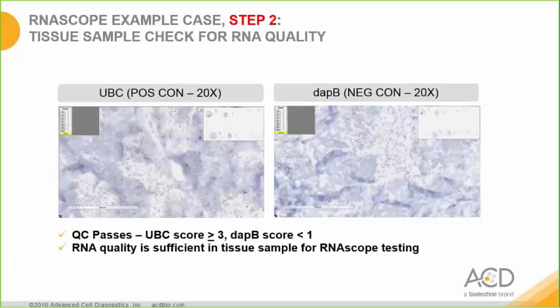Having confirmed the proper technique for running the RNAscope assay, we can now proceed to checking the tissue sample for RNA quality. The same control probes are used here, UBC and DapB. The sample passes with a score of 3 for UBC and a score of 0 for the DapB, indicating that the RNA quality in the tissue sample is suitable for RNAscope testing.